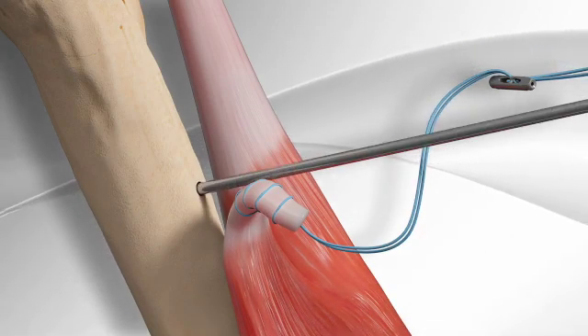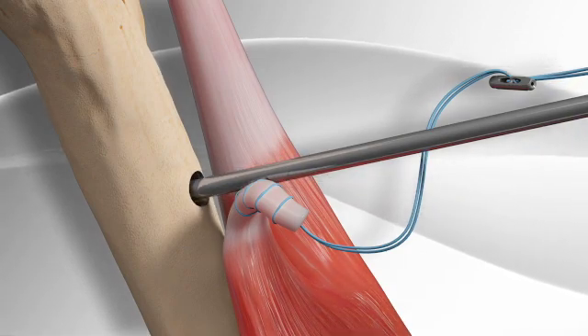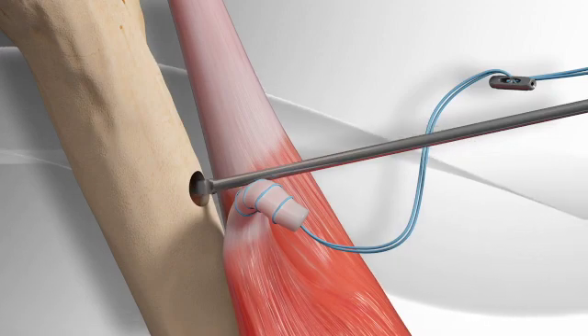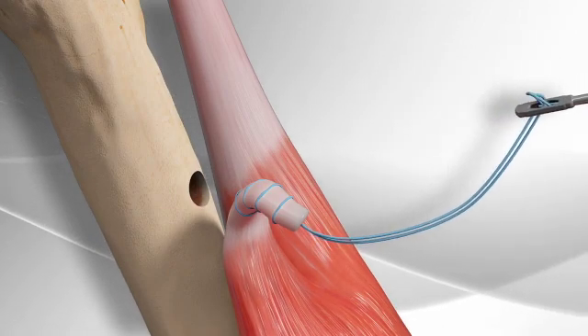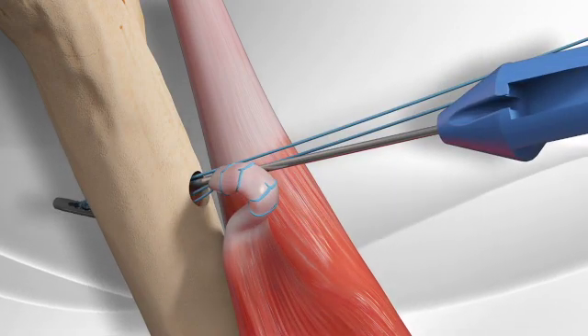A hole is drilled through the bone with a pin and a socket is then drilled over the pin. The surgical button is inserted through the socket and then flipped.